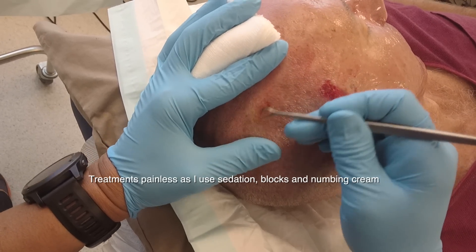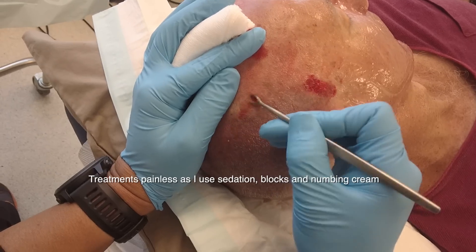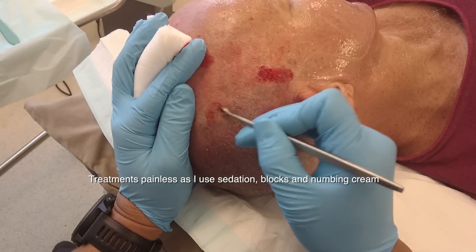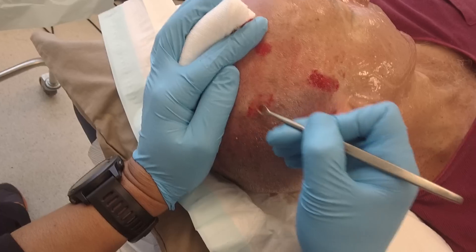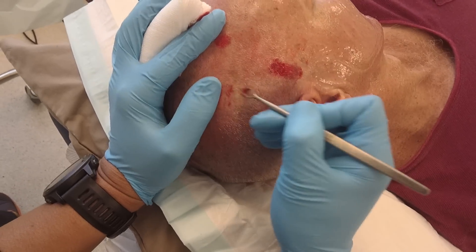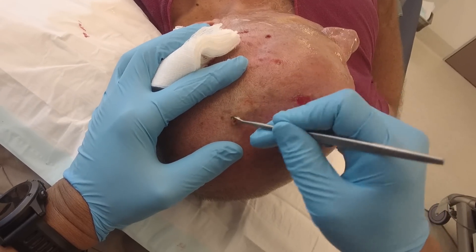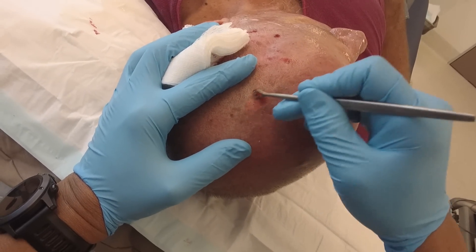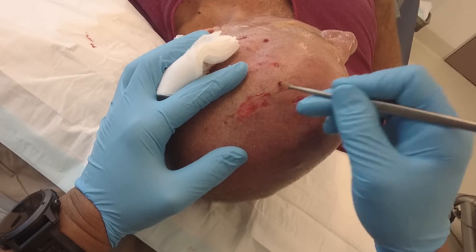Treatments are entirely painless. In this area I use sedation, but also blocks and numbing cream, so the patient feels basically zero. This goes on for about 5 to 10 minutes, but we'll speed up the camera a little. You can see me just scraping away at hundreds of these lesions. The patient's nice and comfortable.